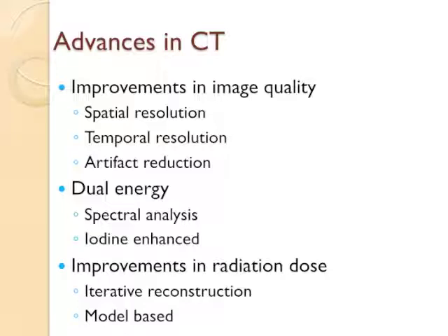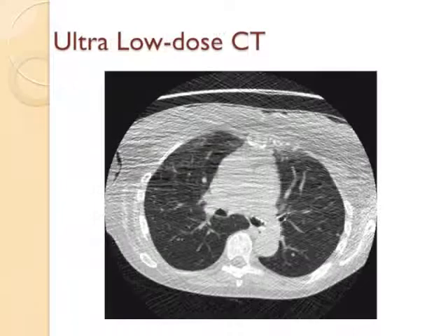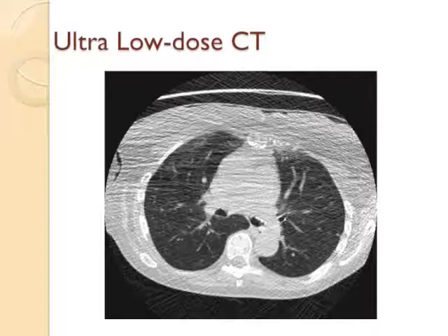And there's also been tremendous improvements in radiation dose, which I'll just show you briefly, because this has always been a concern with CAT scans, and you hear a lot about that in the news, about dose from radiation. Well, at least in the chest, the dose is being able to be dropped dramatically, to the point now where this is an ultra-low dose scan that's sort of experimental, but this is basically the equivalent dose.